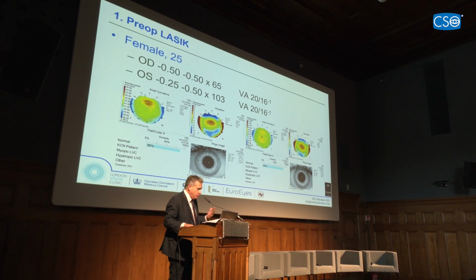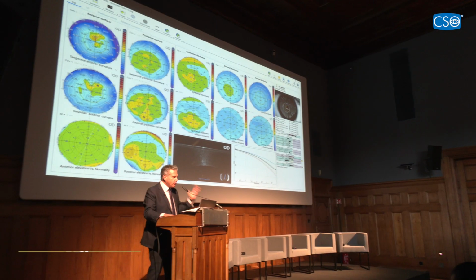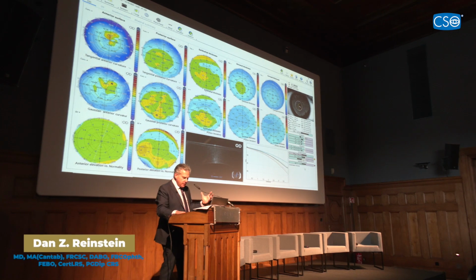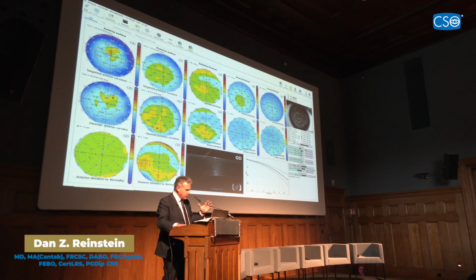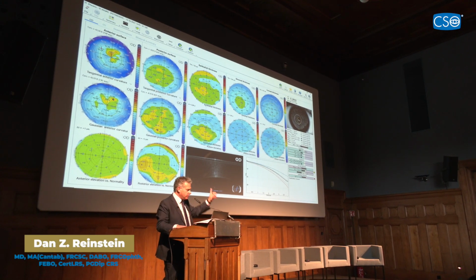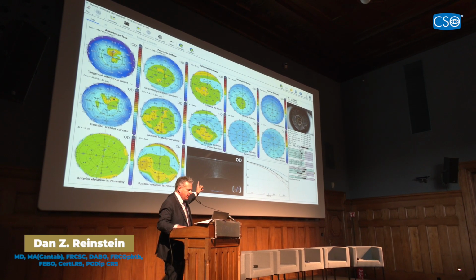In other words, I open this, I don't just look at printouts, I open the software. This is the right eye, okay? Now, here's what's interesting, right? You've got your anterior surface, your tangential curvature, and you can see that there's this little steepening above.